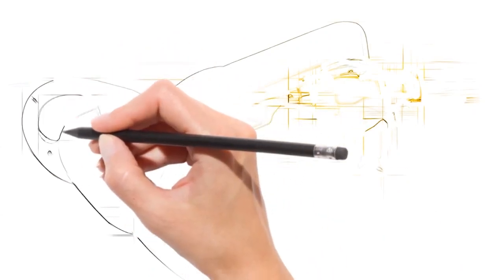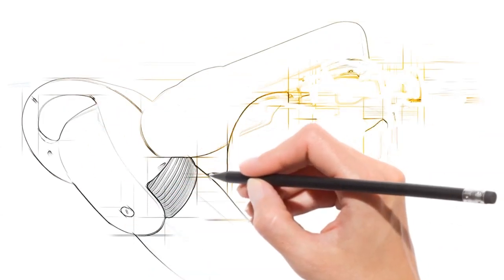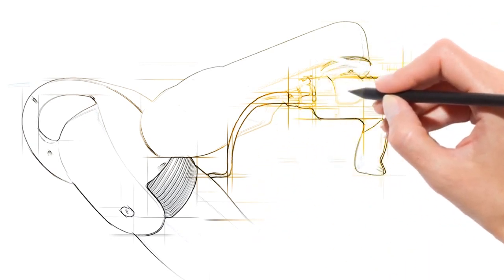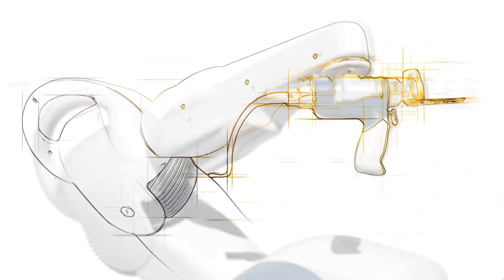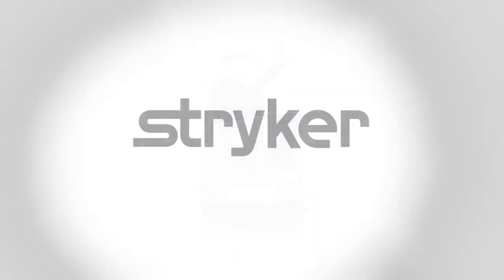The changing healthcare environment is creating uncertainty for many. MAKO robotic arm assisted surgery enables you to have a more predictable surgical experience and offers you a leadership advantage in our evolving healthcare environment. Let's create the future together, with MAKO Total Knee.